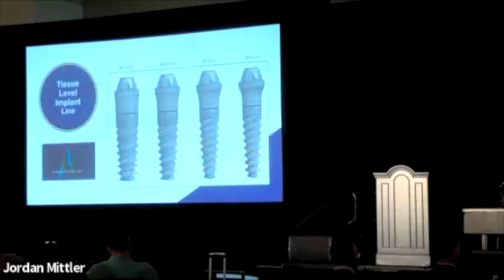And with these implants, I think there's always a place for the 3.3 millimeter diameter. There are cases where there is an abundance of bone, and you want to preserve. Bone is much more important than the titanium, in my opinion. And with good buccolingual bone, a smaller implant size in a full arch, the biomechanics is not the same as a regular implant restoration. That splinting around the arch really takes away from the advantage of whether it be a 3.3 or a 4.2. It doesn't really matter. The larger diameters, to me, are good just in case you've over-prepped and you need the ability to get that immediate fixation.